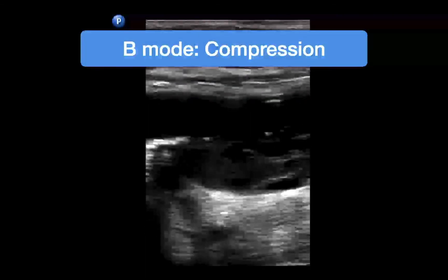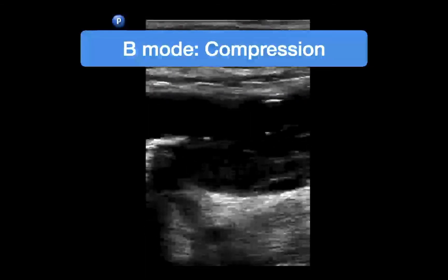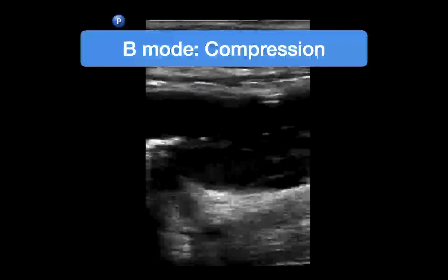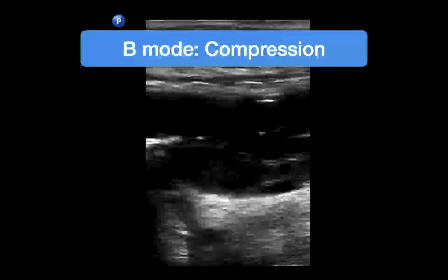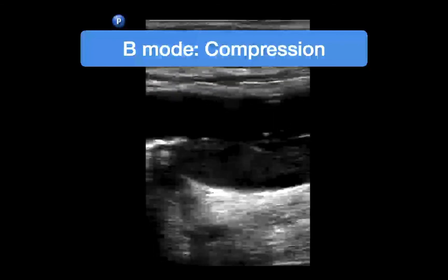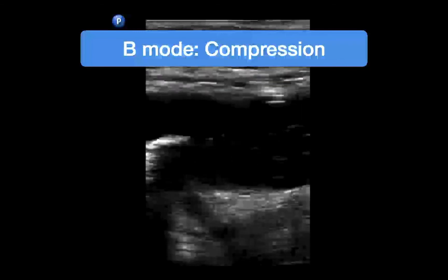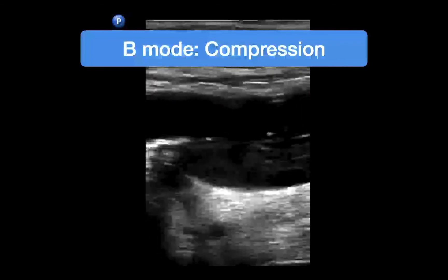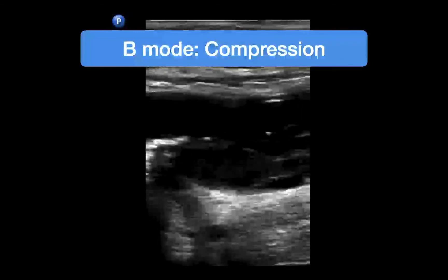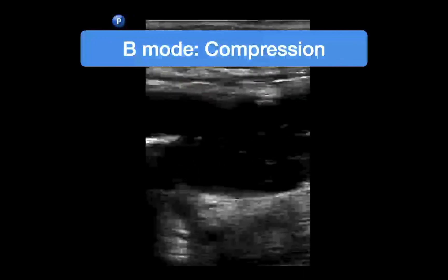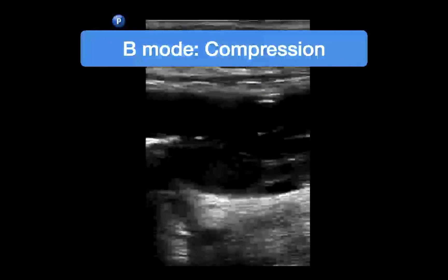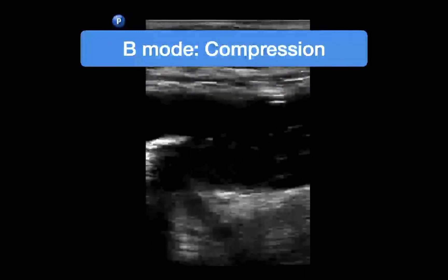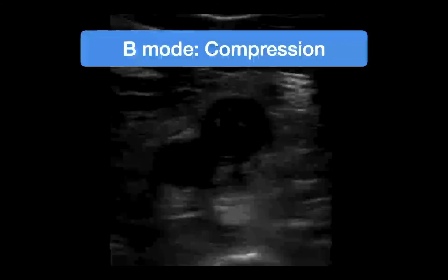Here's an example of a DVT in long axis. You can see the artery on top and the vein on the bottom. What you'll notice is echogenic material within the lumen of the vein. When you press on this, the vein is non-compressible — you're not going to be able to compress the DVT away. That non-compressibility is the hallmark of what you're looking for to identify the presence of a DVT.